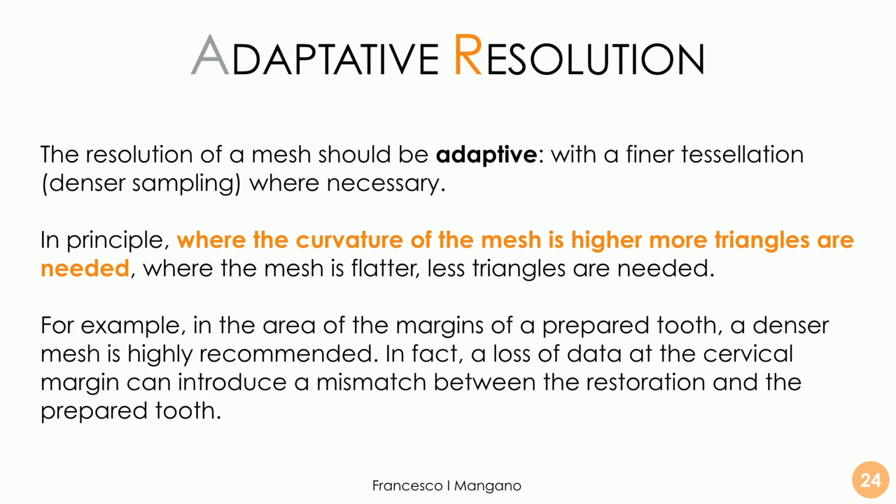The resolution of a mesh should be adaptive, with a finer tessellation where necessary. In principle, where the curvature of the mesh is higher, more triangles are needed. Where the mesh is flat, fewer triangles are needed.